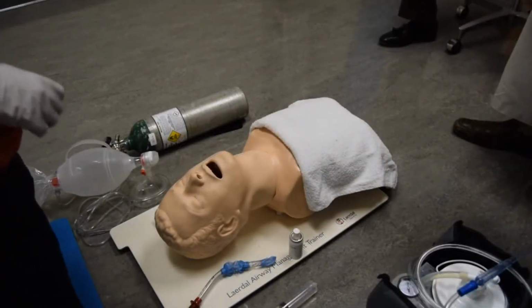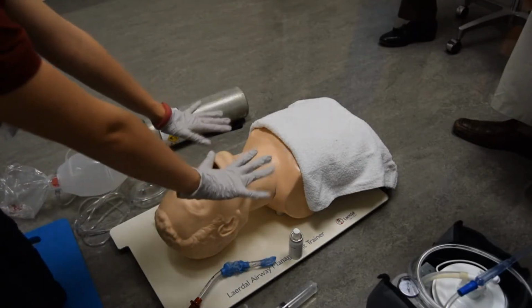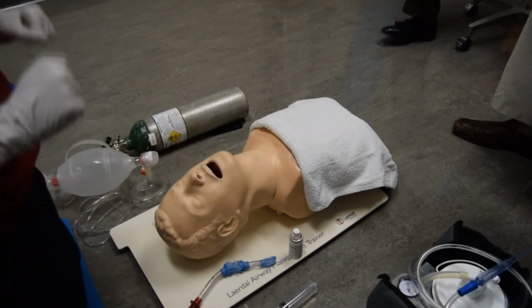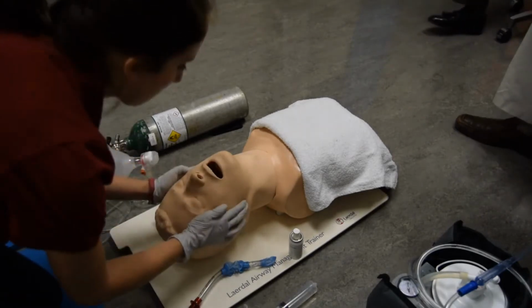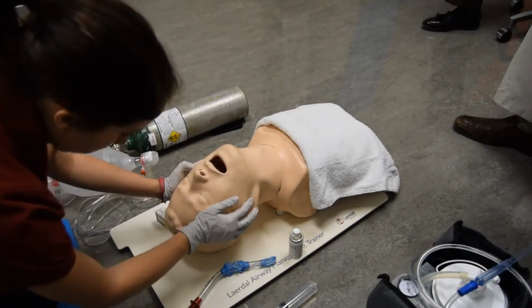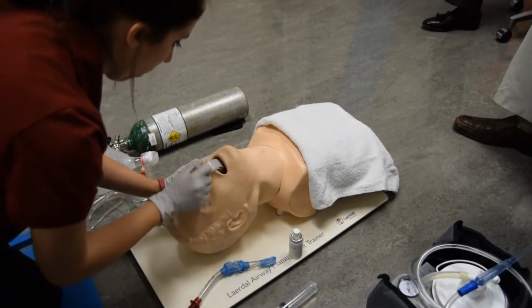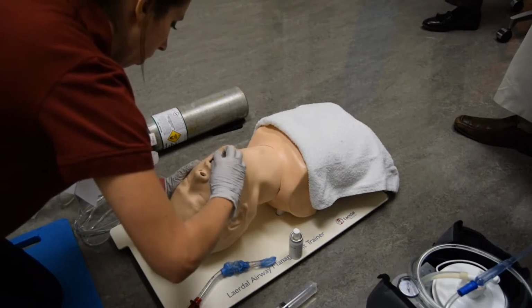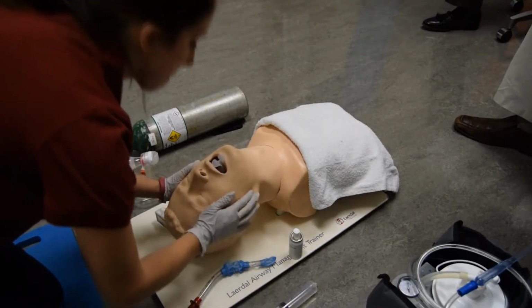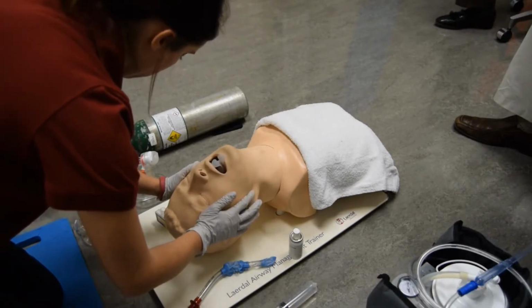Takes or verbalizes body substance isolation precautions. Scene safety, BSI. Opens the airway manually. Elevates tongue, inserts simple adjunct. Examiner now informs the candidate no gag reflex is present and patient accepts the adjunct.